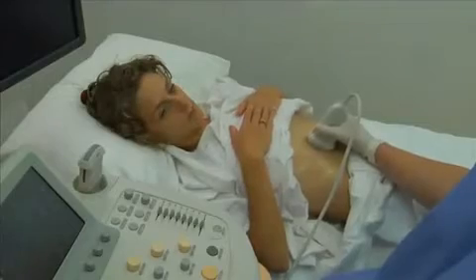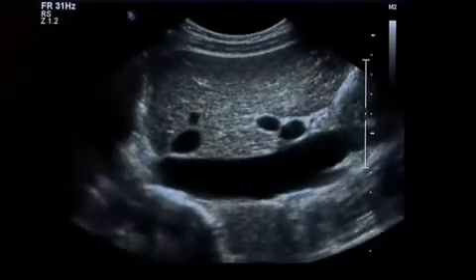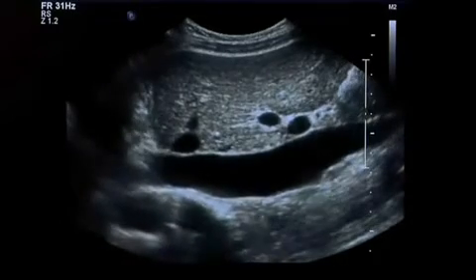Ask the patient to take a deep breath and hold it. This displaces the liver downwards and improves the acoustic window.